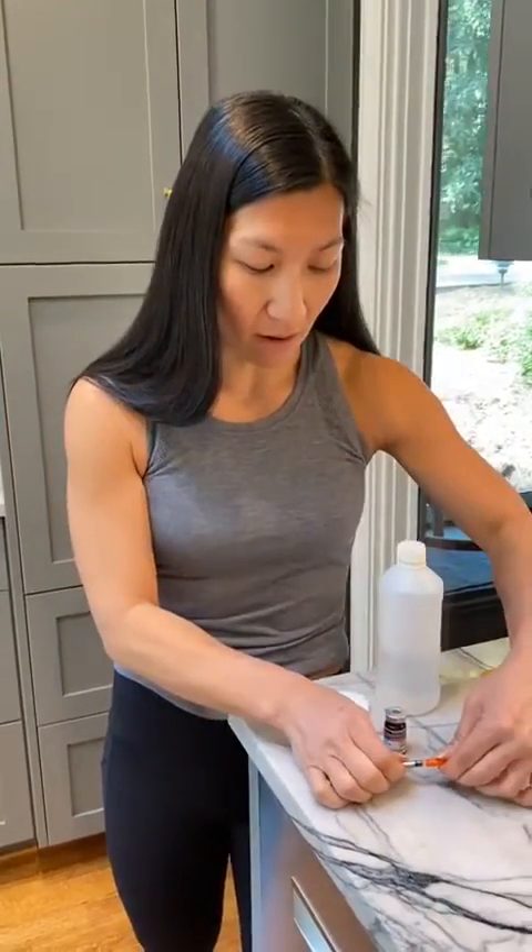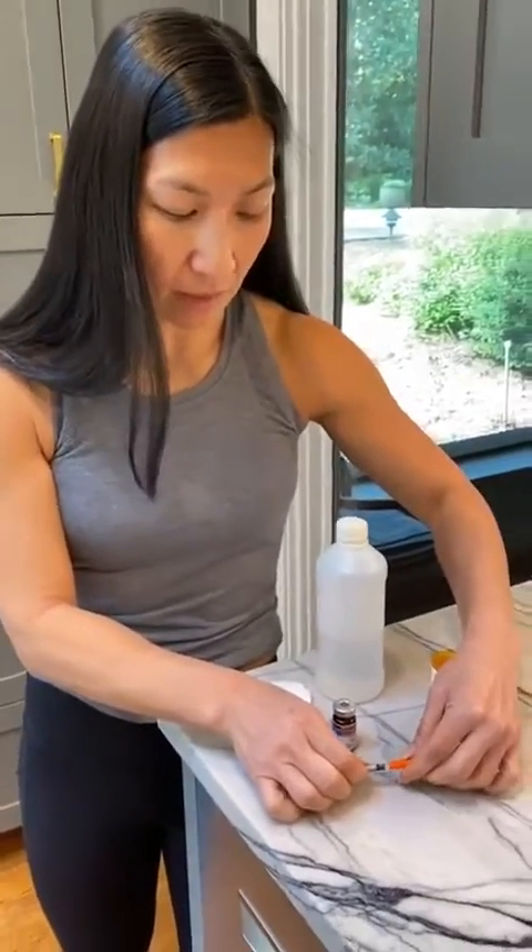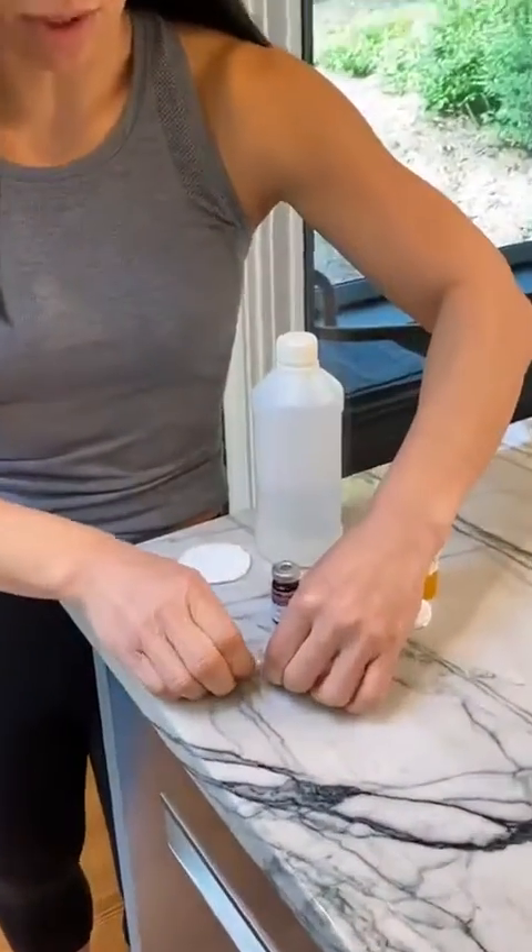We're going to go ahead and loosen off the tip of the insulin syringe, just so it's easy to get off. And then we're going to take off the plunger.